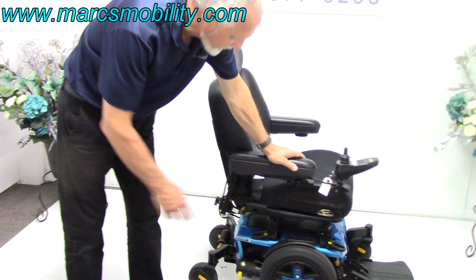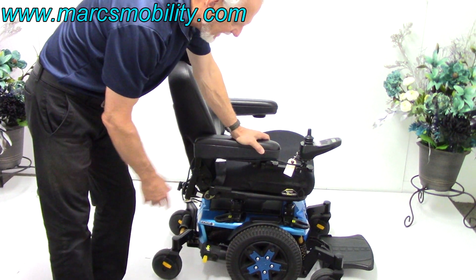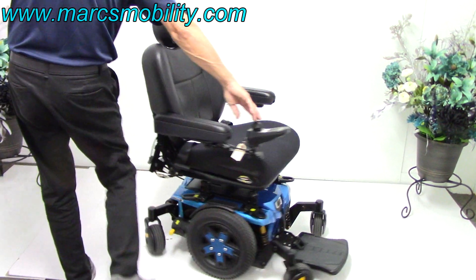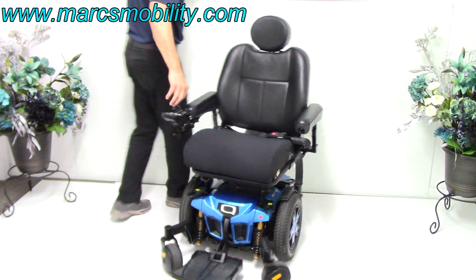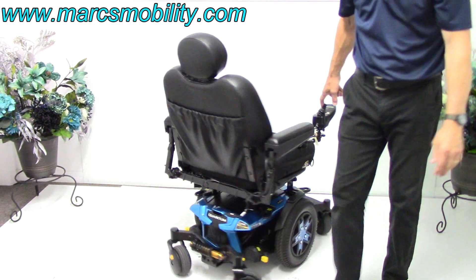This is a mid-wheel drive power chair. This chair will turn around its own length — if I put a box in front and a box behind, I can turn this chair in a circle all day long without moving.